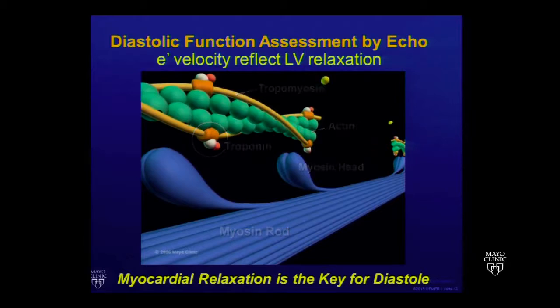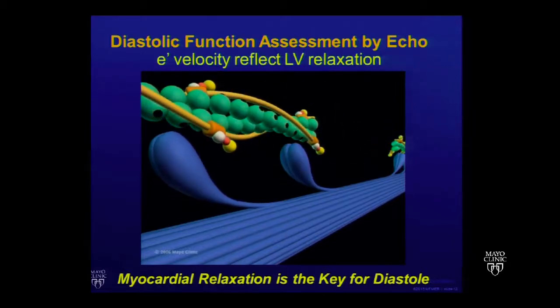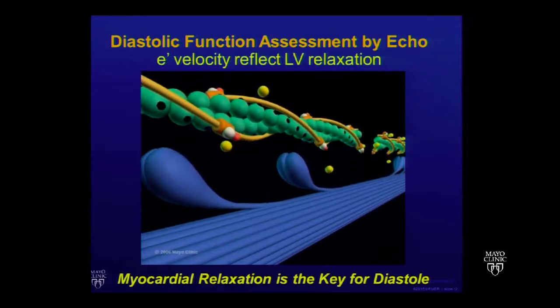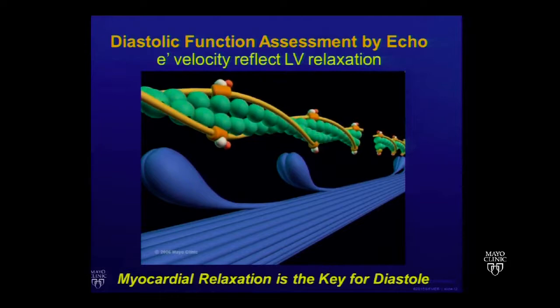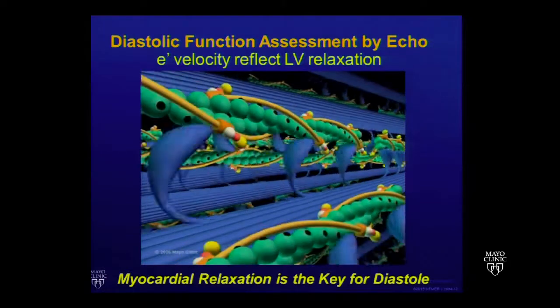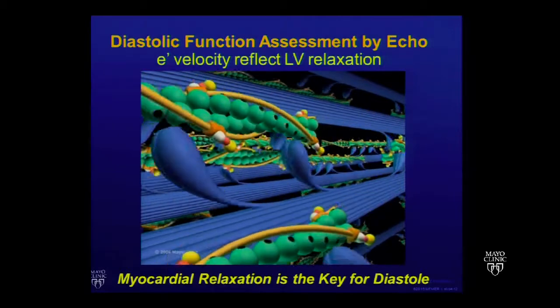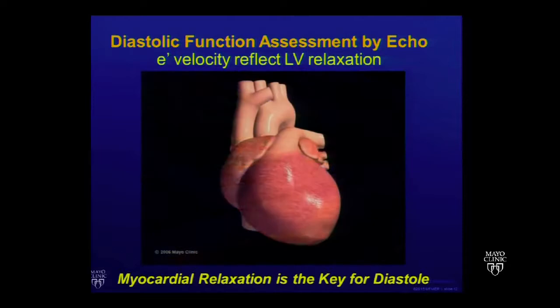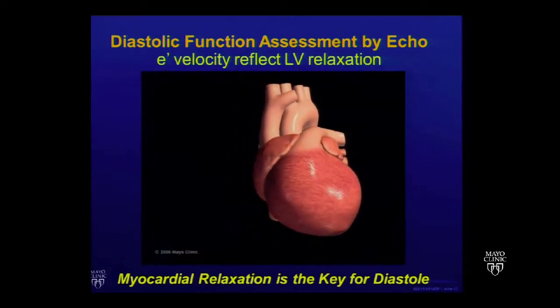When calcium enters the cell and binds to troponin C, that's when contraction starts, right? And then relaxation really happens upon the release of the calcium. It's really precisely controlled to milliseconds, and it happens every cardiac cycle. We can look at that from the apical four-chamber view. Let me show you the apical four-chamber view.